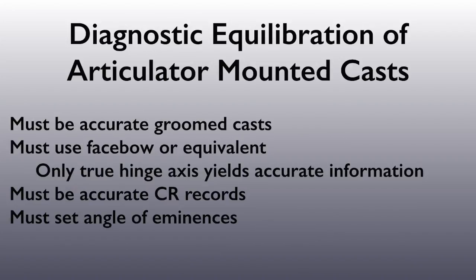To get this job done accurately and efficiently, there are a number of skills which one must be able to do well. It all starts with having accurate casts to work with. Dr. Tom Abrahamson produced an excellent video on how to take proper alginate impressions and make accurate casts. It covers the entire subject in exquisite detail.